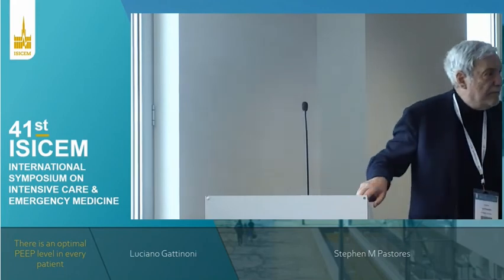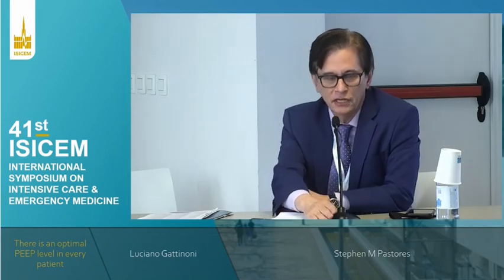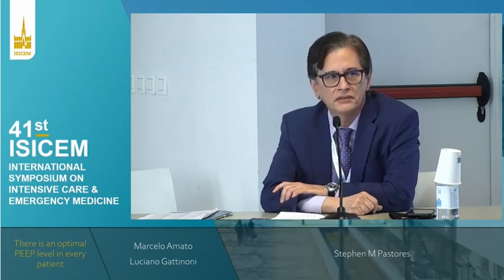There's another session following very shortly, but we can probably take a minute. It's a pro-con session, so I'll ask Dr. Amato to counter Dr. Gattinoni's assumption. As much as I like physiology and like to base my settings on physiology, like Dr. Amato, I'm also convinced that it's really a risk-benefit. And so I'm never below 5, and I'm generally never above 15. So my sweet spot has been in that 10 to 15 range, but I'll let Dr. Amato share his views about that.